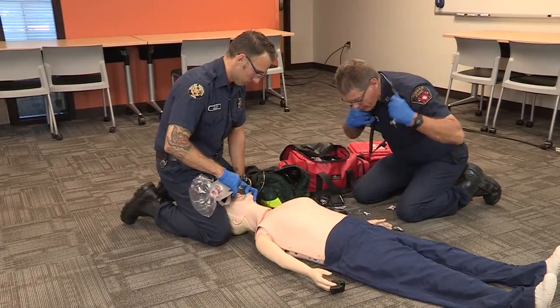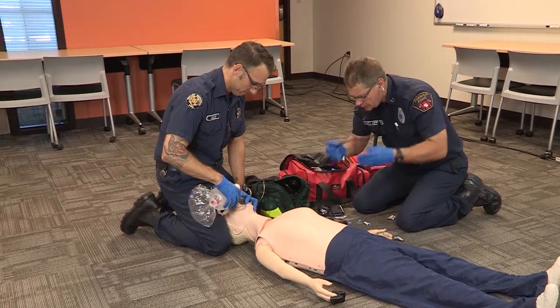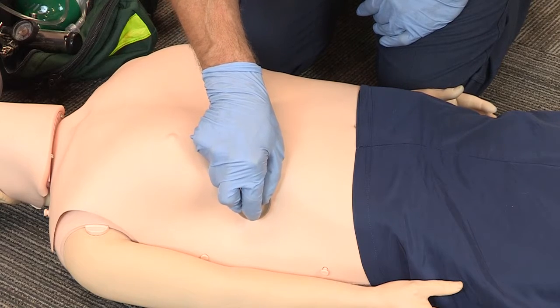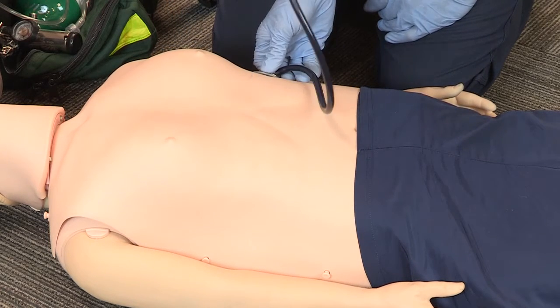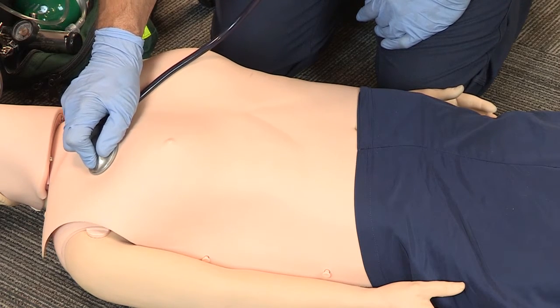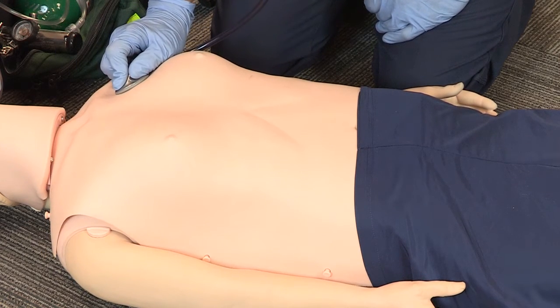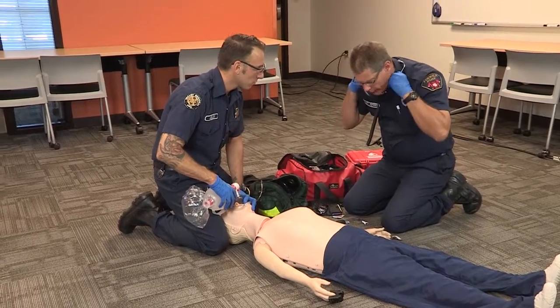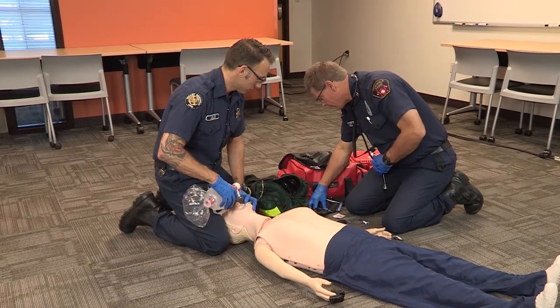Reed, we're going to go ahead and listen to lung sounds and see how those are doing. Lungs are clear, equal, bilateral. Our blood sugar is 102.